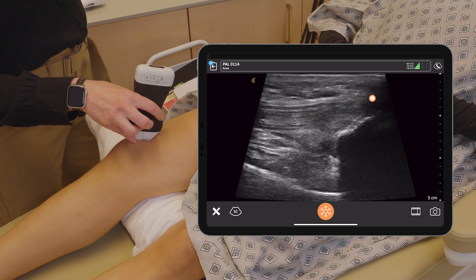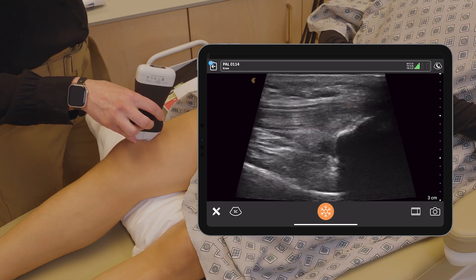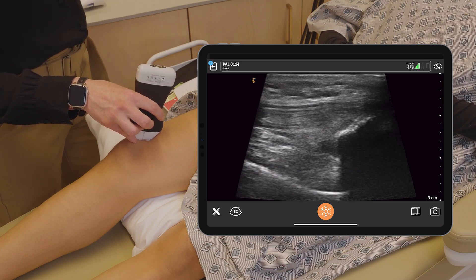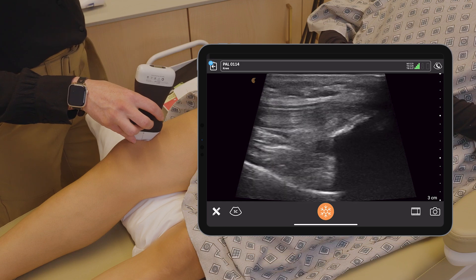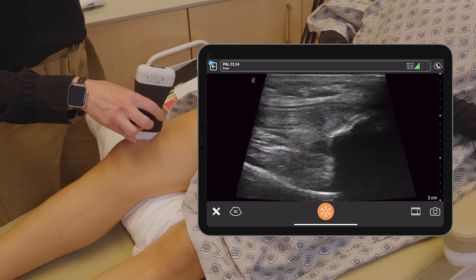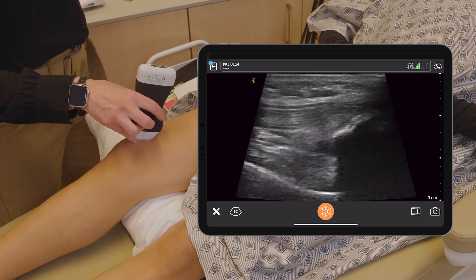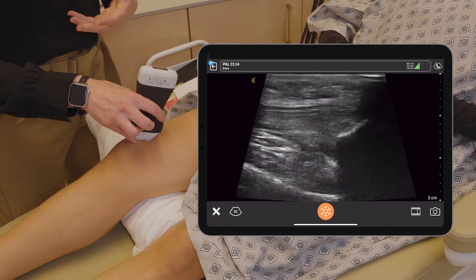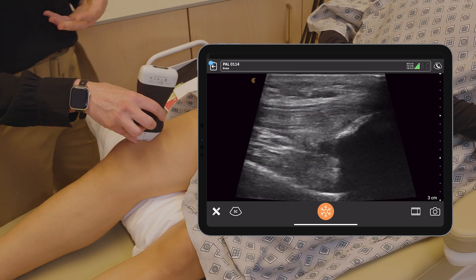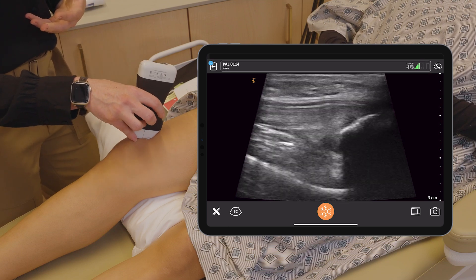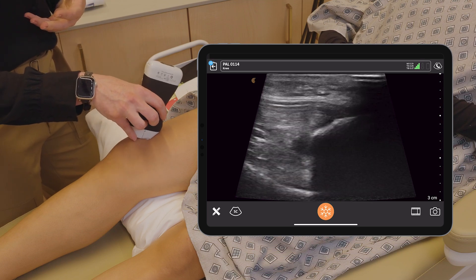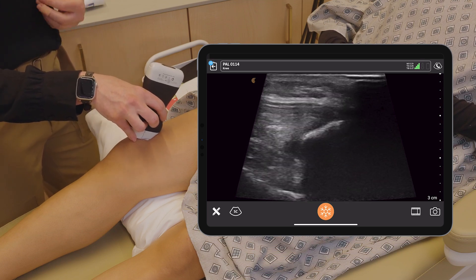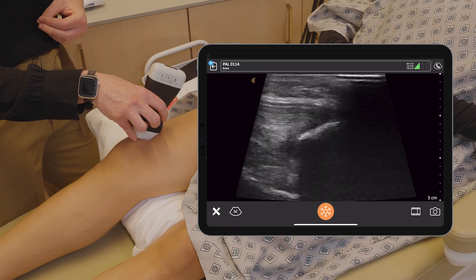If I rock my probe and get it more perpendicular to the tendon, that hypoechoic area just disappeared. This is a normal property of tendons, nerves, and other structures visible with ultrasound. So just make sure you rock your probe if you see a hypoechoic area on the tendon.